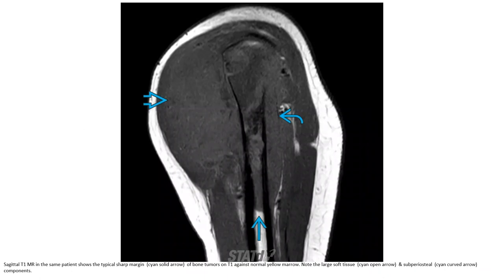This is a T1 MRI in the same patient, showing the typical sharp margin of bone tumor on T1, with normal yellow marrow signal. Note the large soft tissue and subperiosteal component.